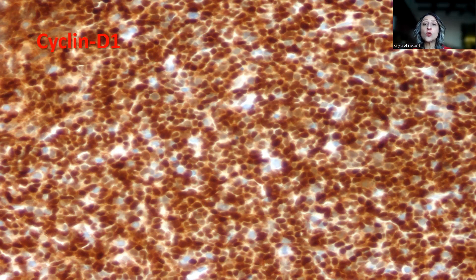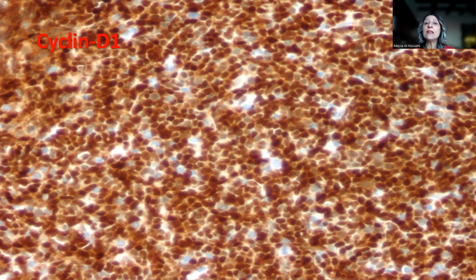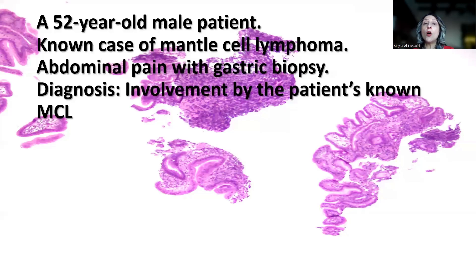I worked up the case with these three immunohistochemical markers because the case is already a known case of mantle cell lymphoma. Otherwise, I would have worked it up with more details if the patient is not a known case of lymphoma. The final diagnosis in this case was involvement by the patient's known mantle cell lymphoma.